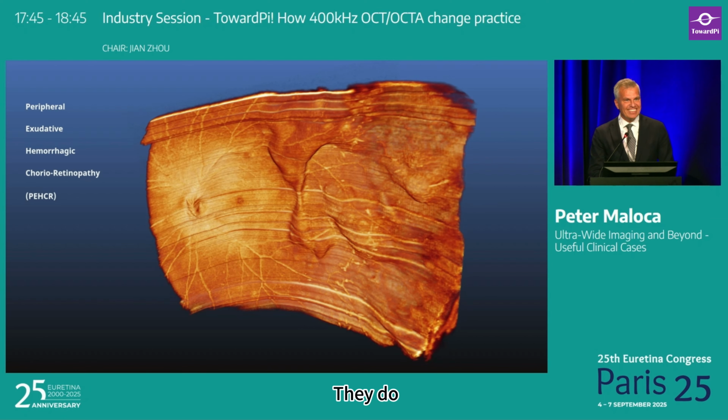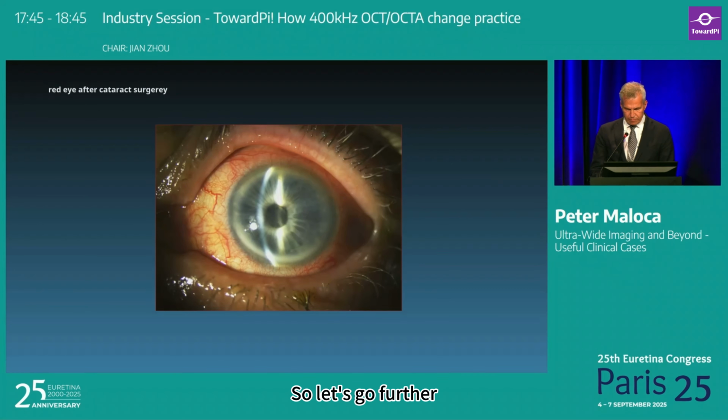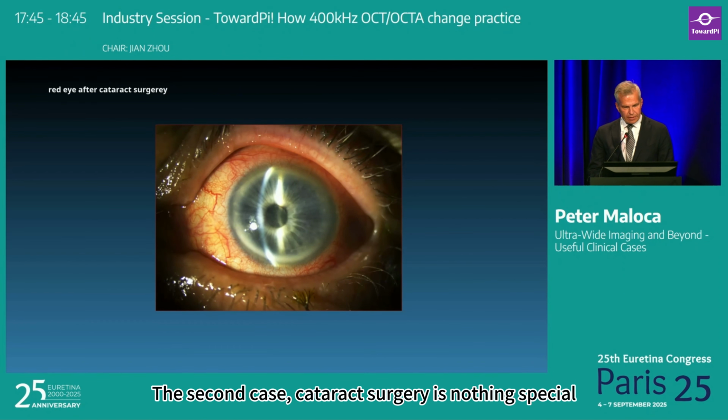They do. In the first case also, I did a cataract surgery. Afterwards, we did a DSAEK and this anti-VEGF treatment. And the patient responded quite well and had a corrected VA of 1.0, so 100%, and he was quite happy. So let's go further. The second case.